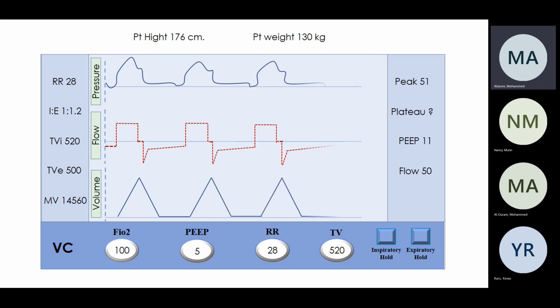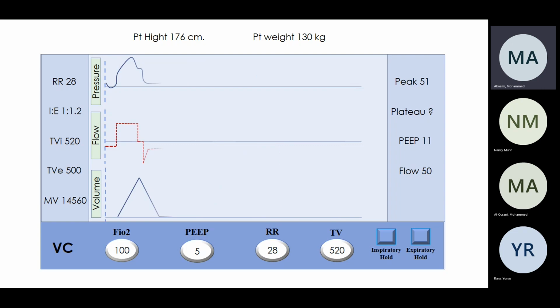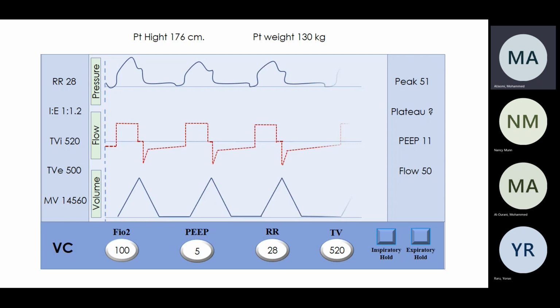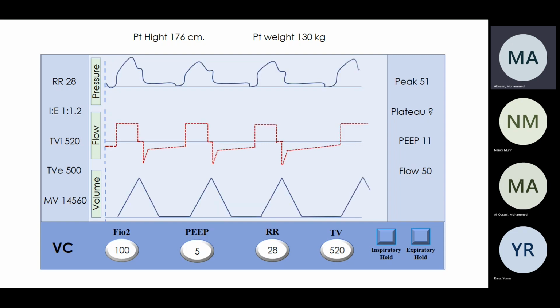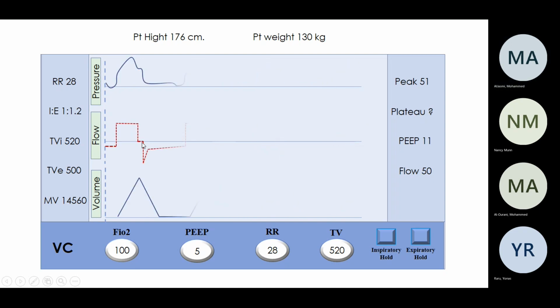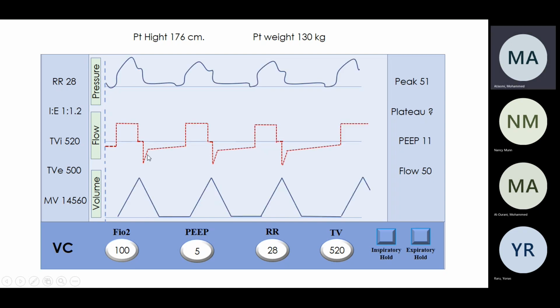Where should you see the changes if the patient is pulling more or not? On the pressure, which is the variable. So I'm controlling the flow and the volume, so I will not see it in there, during expiration or inspiration. What do I see in here? There's no flow in here, and there is something down in here. Is that right? In our COPD patients.